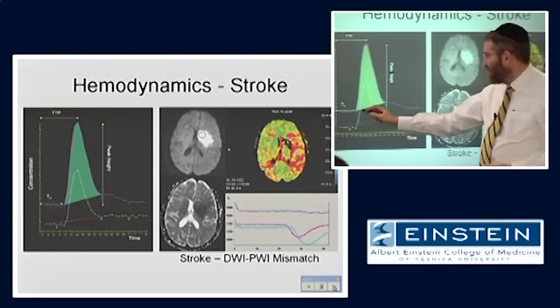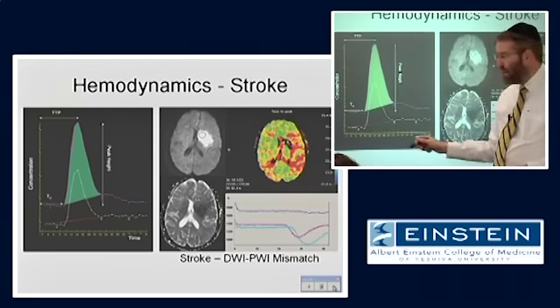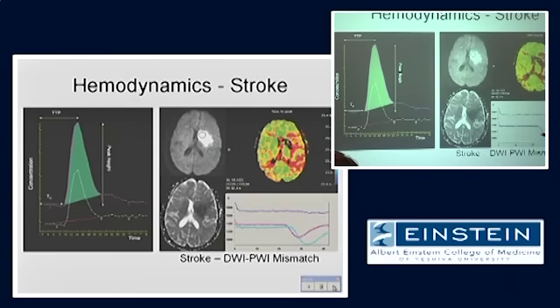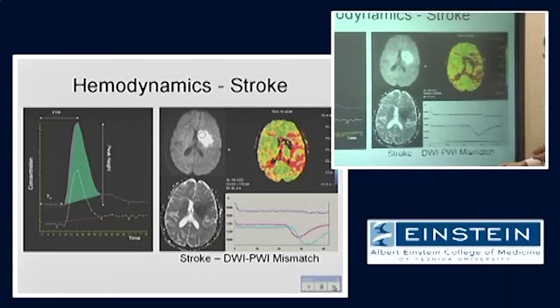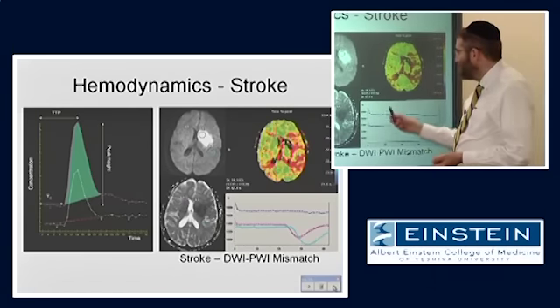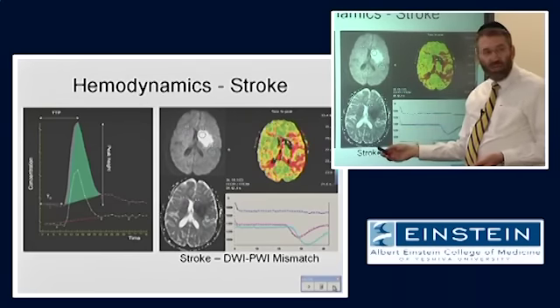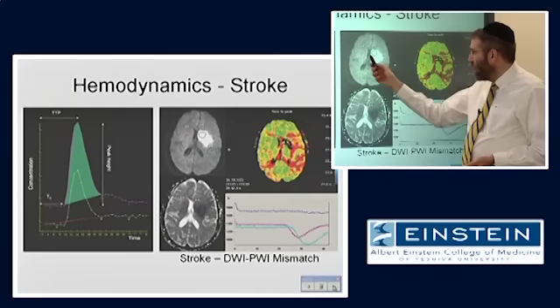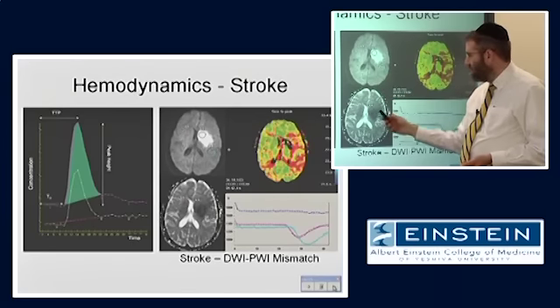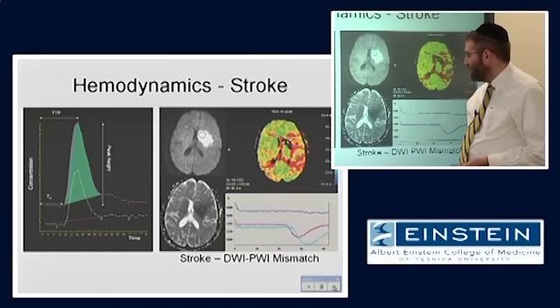And this just shows you how we can perform different hemodynamic measurements on this data. Here's an example. I think I actually showed you guys this example the other day or a week or 2 ago. This patient has a stroke. Diffusion weighted image at the top, ADC image at the bottom. It's white and low ADC because there is dramatically restricted diffusion.